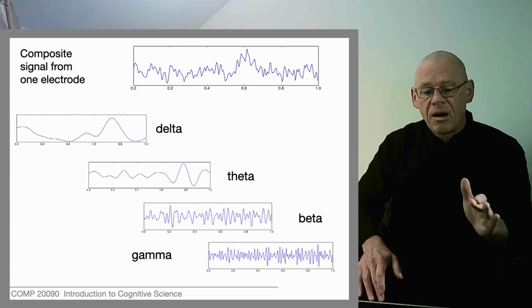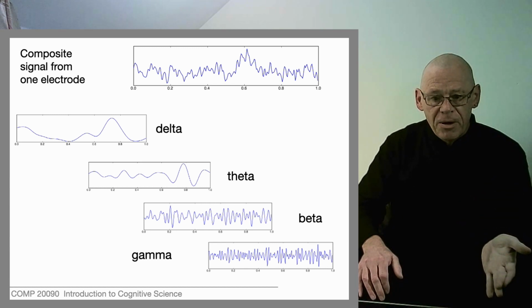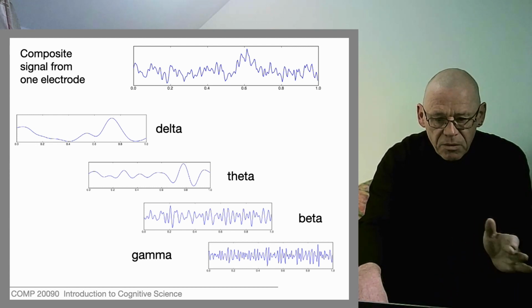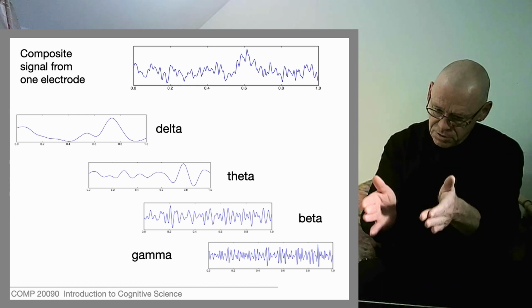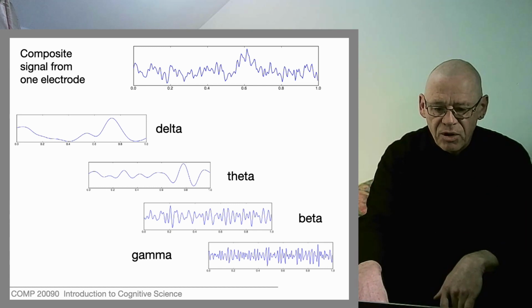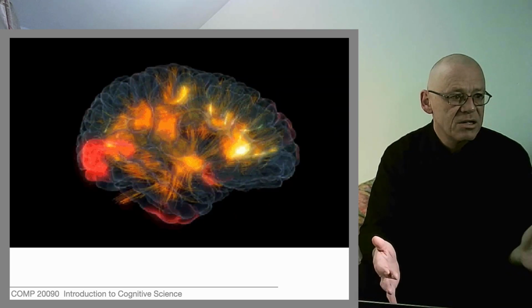So the profile of these component frequencies would look different in a sleeping person than an awake person. That kind of correlation, something we know, states of consciousness, so this person is asleep, this person is awake, and something that changes as that happens. This is going to be clinically very useful. We don't necessarily understand where the signal is coming from.